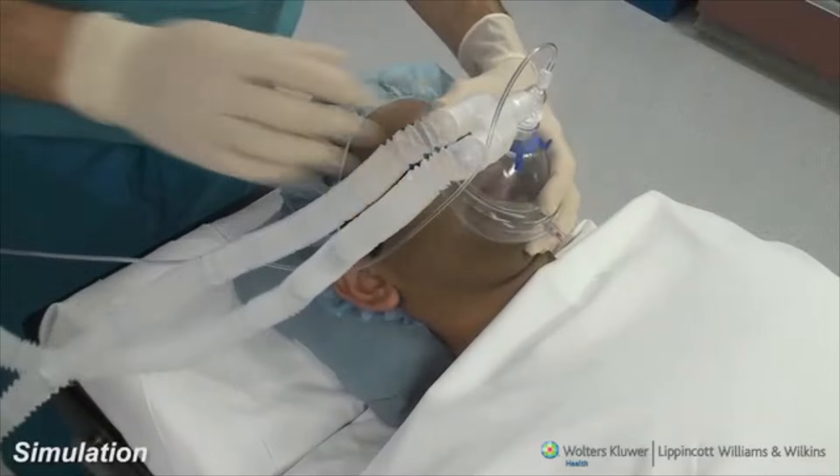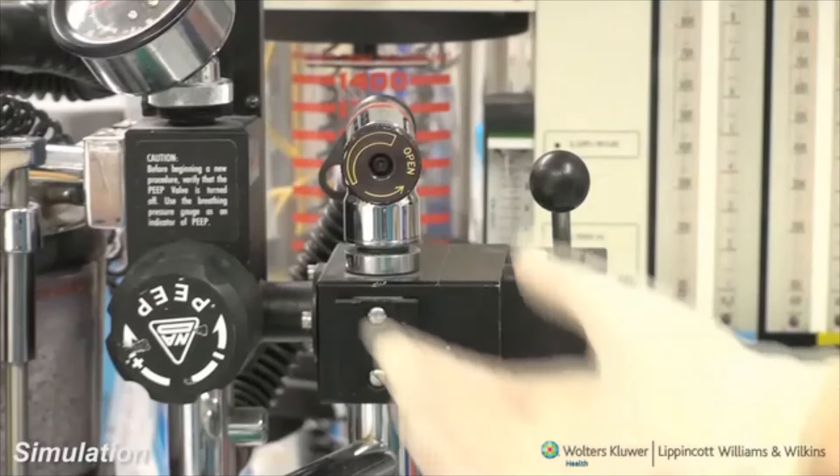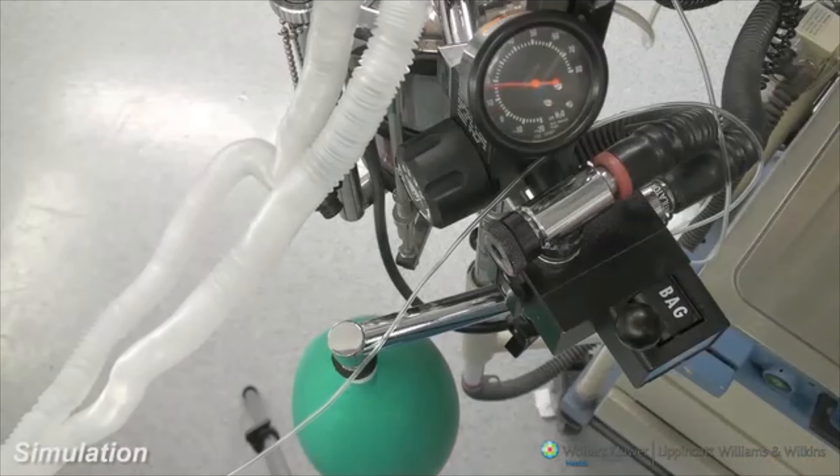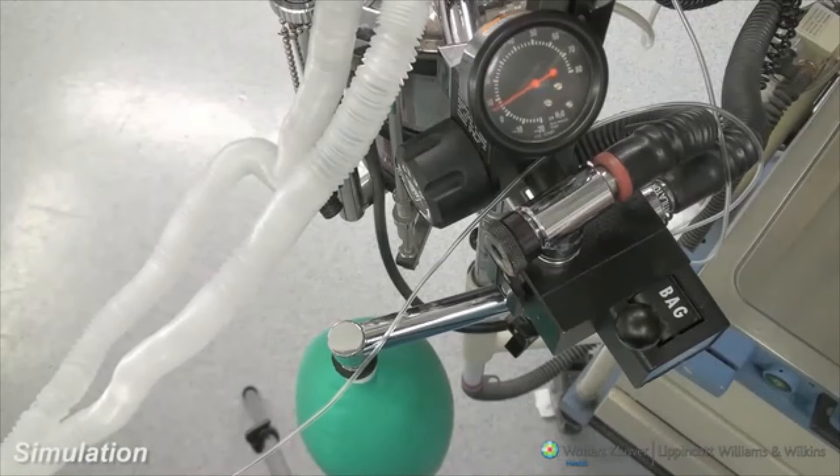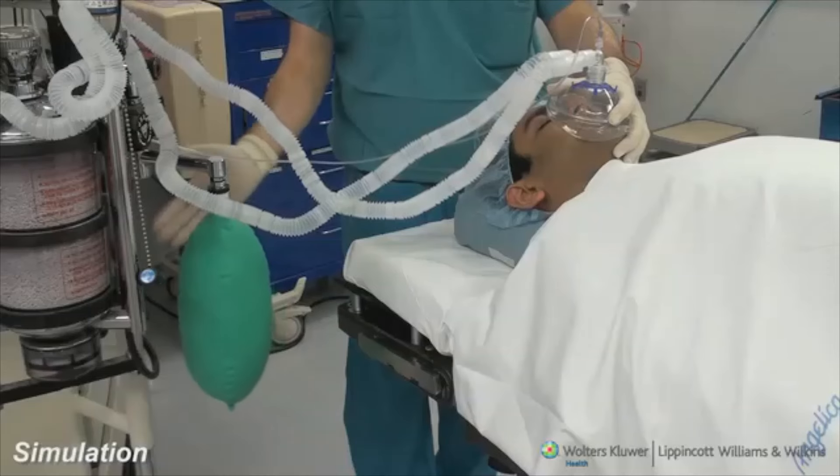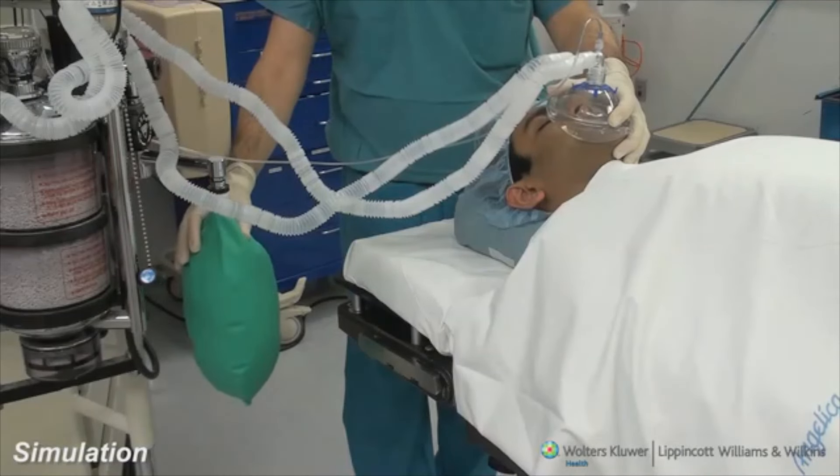When the face mask is applied to the patient and the adjustable pressure limiting valve is closed, the reservoir bag will distend and high pressures will be reached within the breathing circuit. This gives the patient the unpleasant sensation of difficulty breathing.